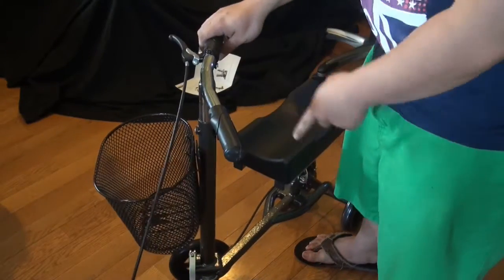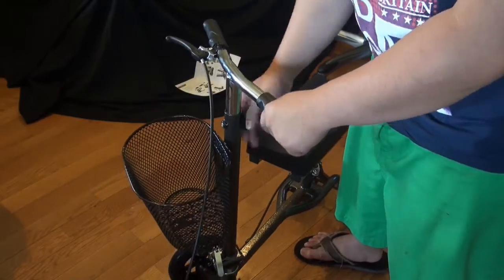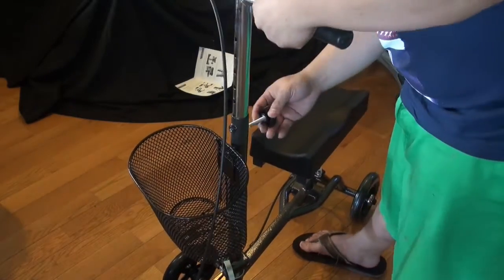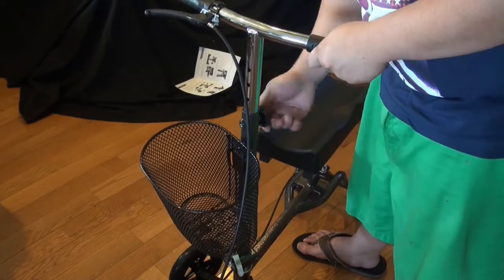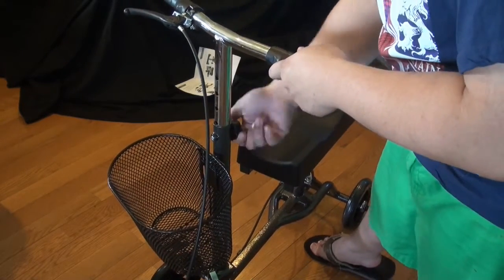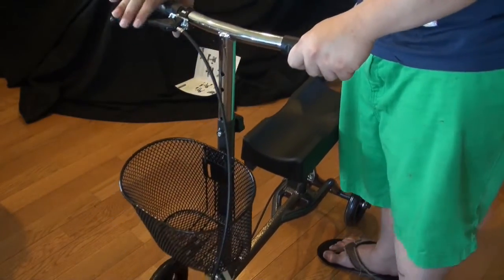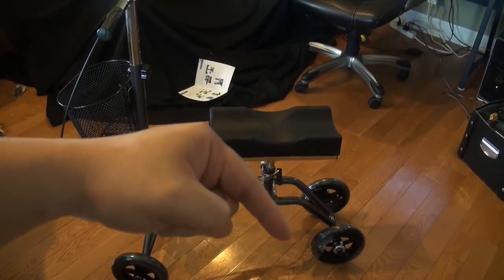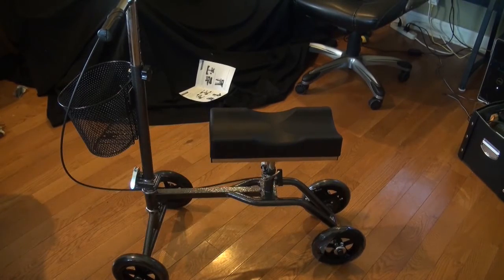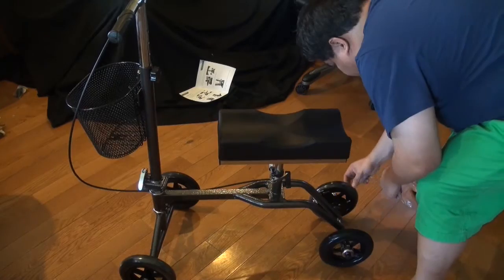By the way, you can actually adjust the handle itself as well to your desired height — you just need to unscrew and screw that back. And lastly, there's plastic covering the wheels, so you just need to remove those and you're ready to go.